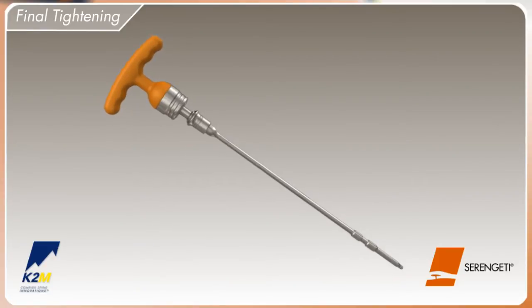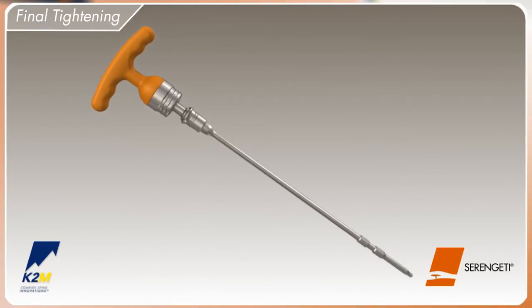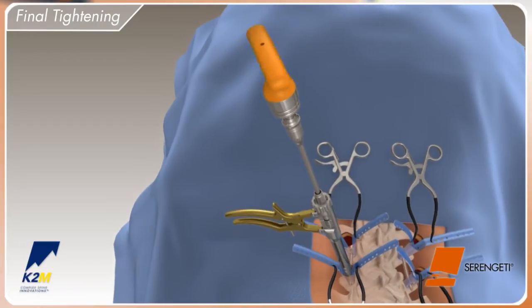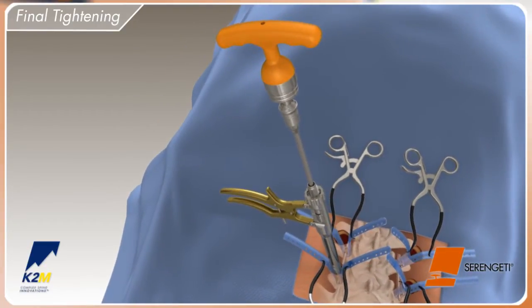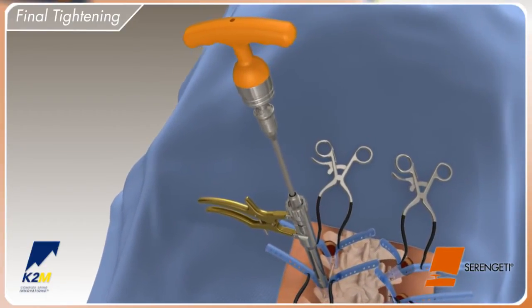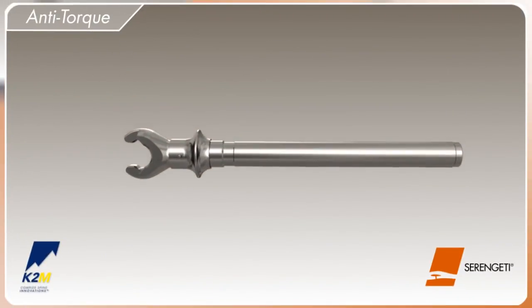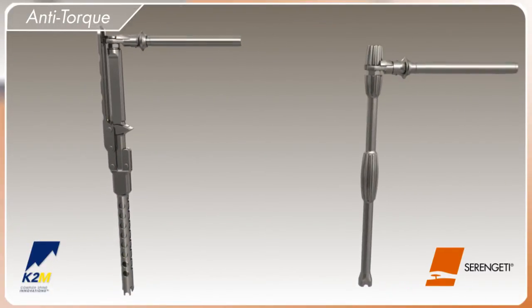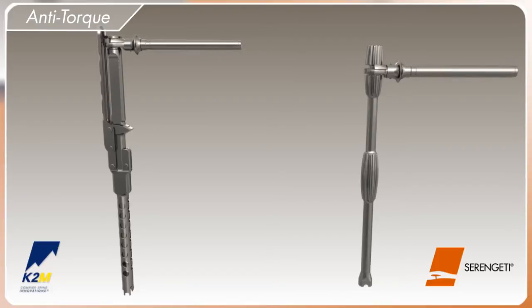The yellow jacket can be used to final tighten the set screw. Attach the torque limiting handle to the MI hex driver and place it down the cannula of the yellow jacket, using the offset handles as an anti-torque. Final tightening is accomplished when the torque limiting handle relieves resistance and emits an audible click. In addition to the yellow jacket, final tightening may also be achieved by using the anti-torque handle with either the praying mantis or anti-torque tube.